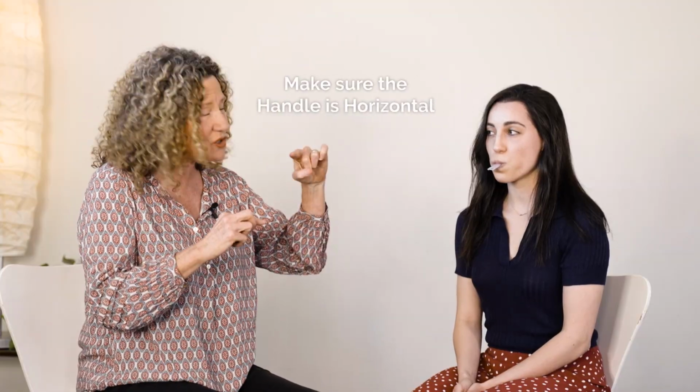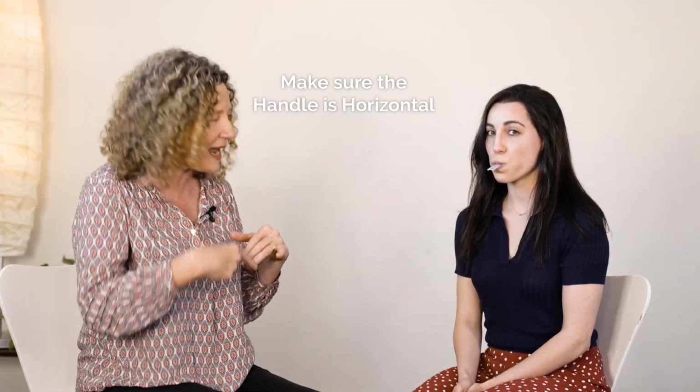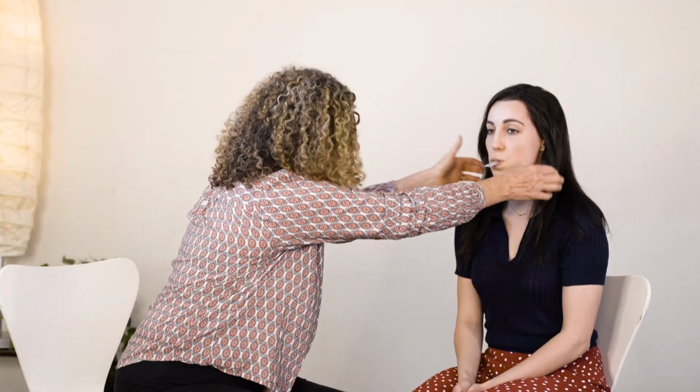They're holding that handle strongly, and it's coming out horizontal. You can see the handle's actually coming out straight. That's quite a good indicator. If the handle's tipping down, that tells us that those lips aren't holding it comfortably and solidly. We're looking for the jaws and the muscles there.